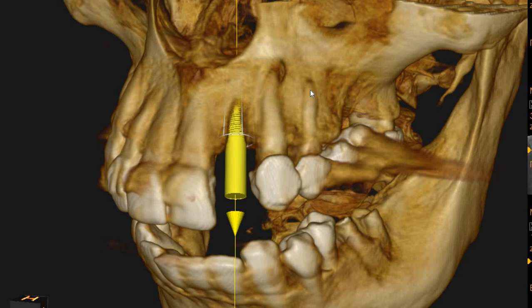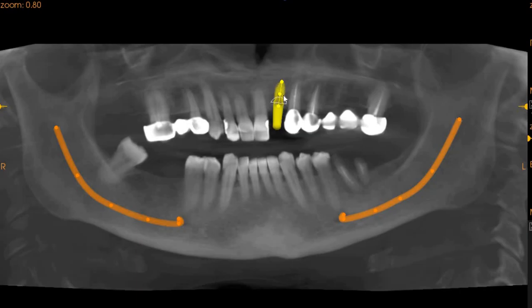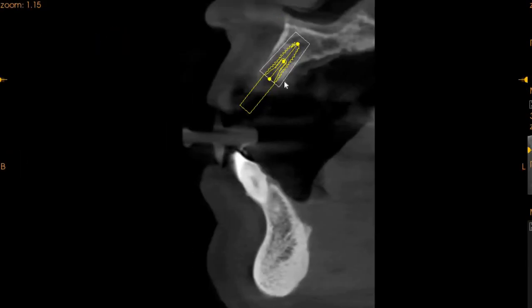The implant will have to be placed slightly deeper, but bone augmentation needs to be done on the buccal aspect; otherwise, thread exposure is going to be quite significant. On the panoramic, we can see that the implant is placed right at the center of the ridge. On the transaxial view, maximum engagement is of the palatal and the apical half aspect, whereas the buccal will be exposed if not augmented with bone.